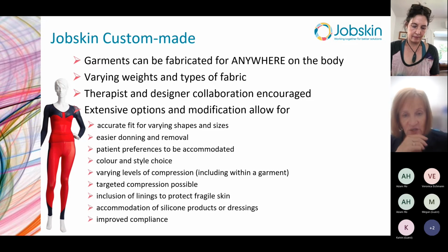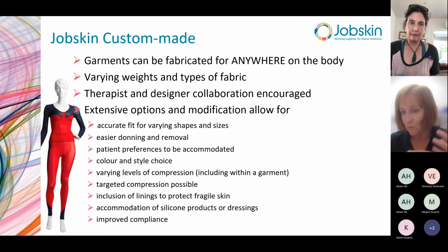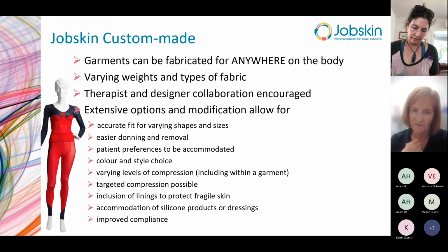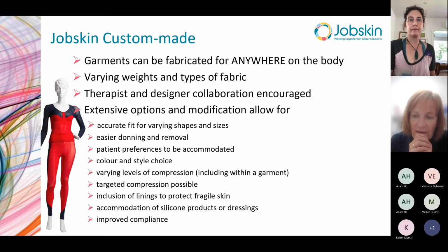varying levels of compression, and that can vary within the garment, not just graduated compression, but you can choose that one leg is one level of compression and the other leg is a different level of compression. We can target specific areas with compression. We can certainly include linings to protect friable skin. And also, this is particularly useful for scar management.